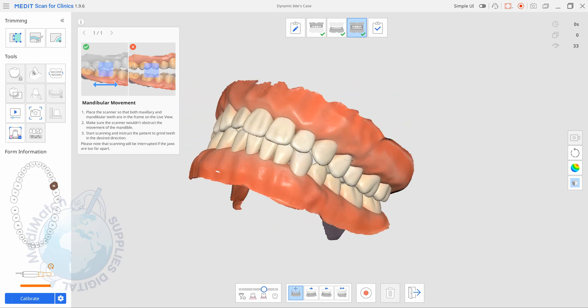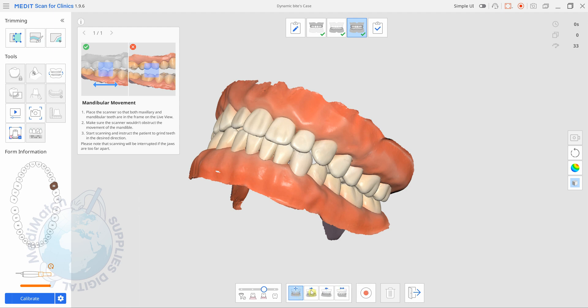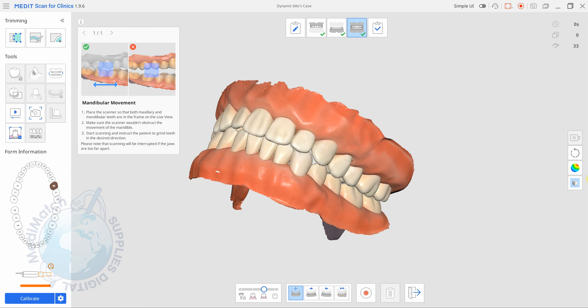At the bottom here we've got these four icons. We've got one for free movement, one for left excursion, one for right and one for protrusion. So we're going to do this on a model so it's not the easiest, so bear with me. I'm going to leave it on the free movement one at the moment and get my scanner into position.